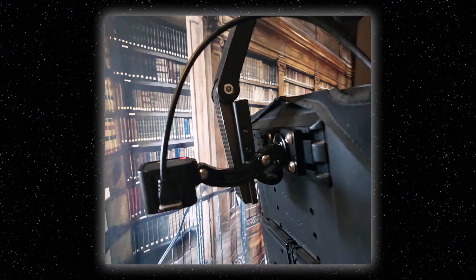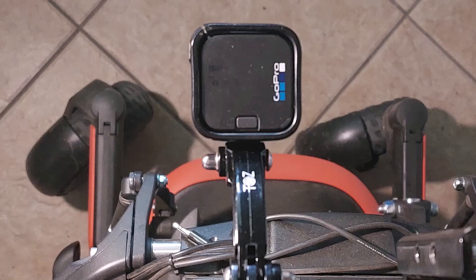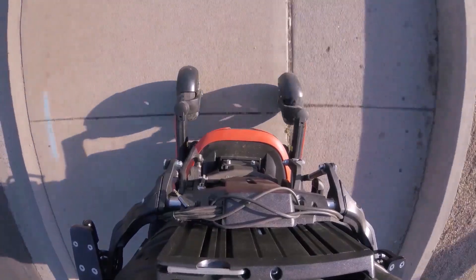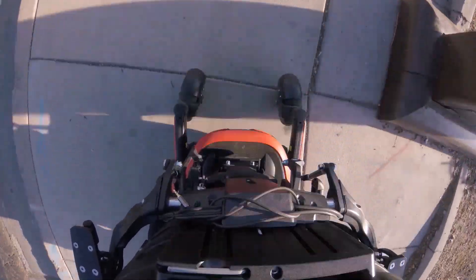After that, I mounted a GoPro on my seat. It recorded several hours of video with 108 incidents of caster flutter. Watch 30 seconds of flutter and you'll see the flutter starts when the caster hits a crack at a steep angle.